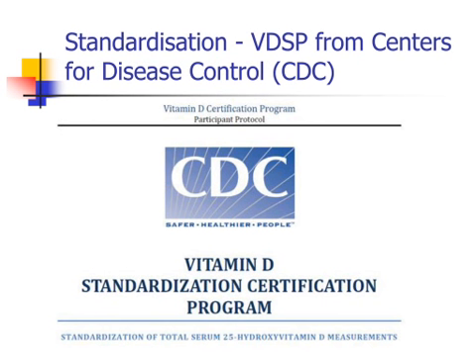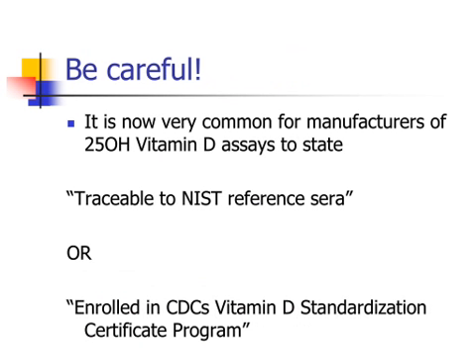Okay, there's a couple of things I'd like to say just to be careful of. It's become very common, well I've certainly noticed it, for manufacturers of 25-hydroxy vitamin D assays or calibrators to state that they are traceable to the NIST reference. But they don't provide the data, so the statement's almost meaningless in my eyes.